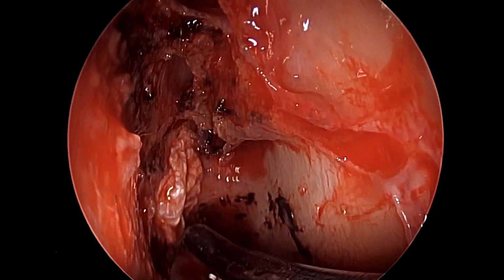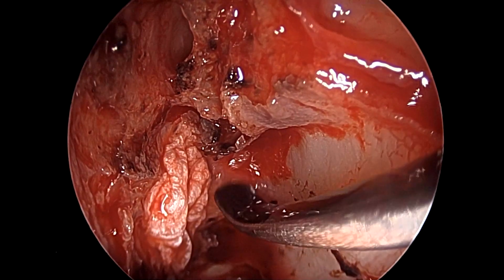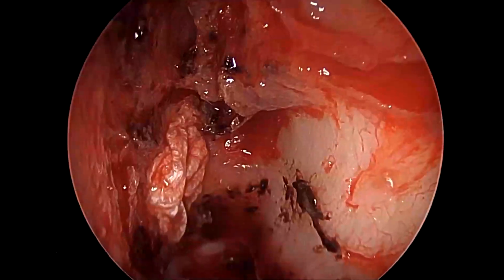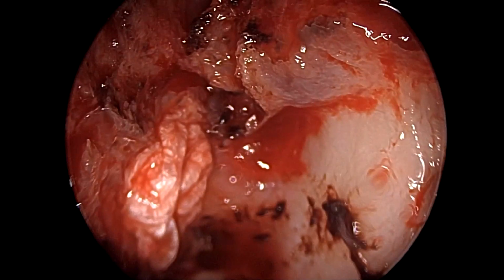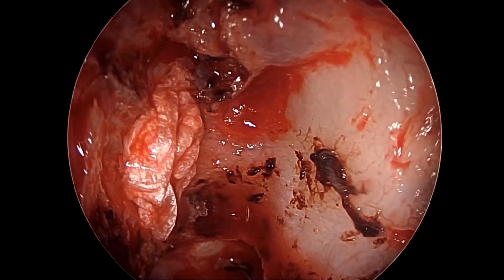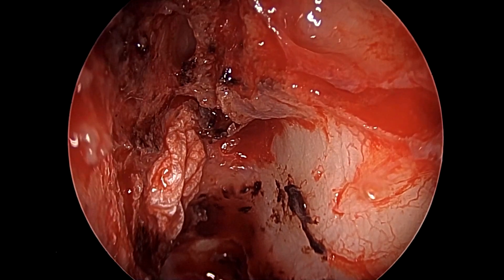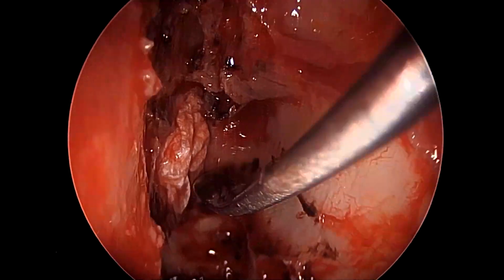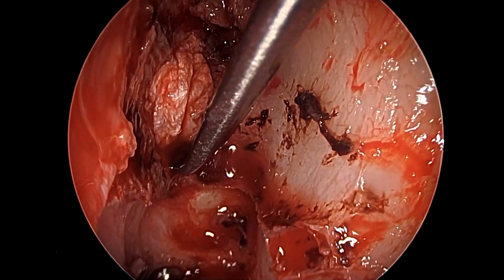Appropriate sizing of these fascia grafts is also fairly important. It must not be undersized, but oversized grafts will never be able to sit in these small defects. So it must be borne in mind very carefully that the grafts must be sized. You can size them by using a frontal sinus curette, measuring the appropriate size, or by using a suture material to measure approximate sizes of the graft material.